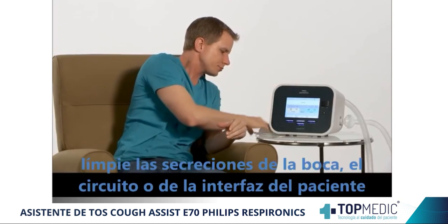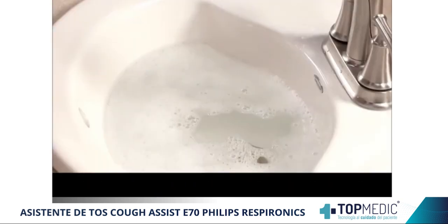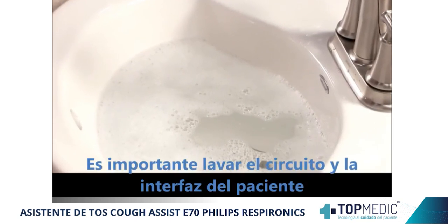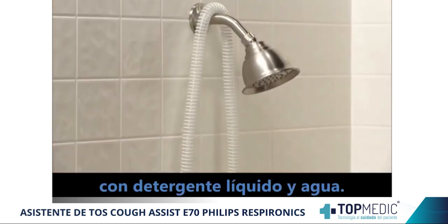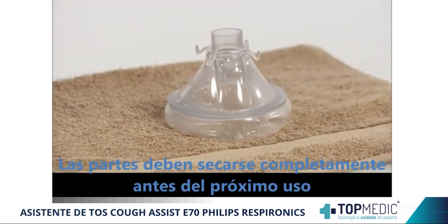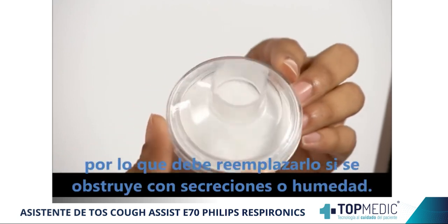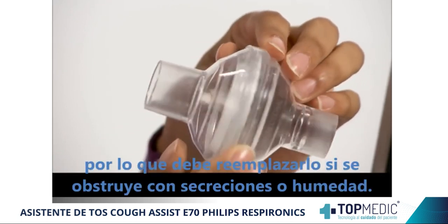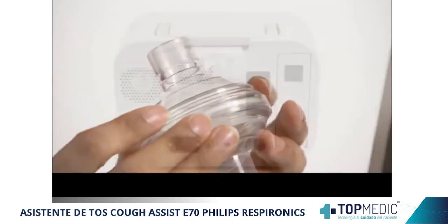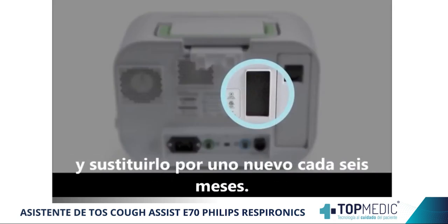After the treatment, clear any secretions from his mouth, tubing, and patient interface. It is important to wash the breathing circuit and patient interface with mild liquid detergent and water. The parts must dry completely before next use. The bacteria filter cannot be washed, so you should replace it if it becomes blocked with mucus or trapped moisture. You should clean the air filter at least once every 2 weeks and replace it with a new one every 6 months.